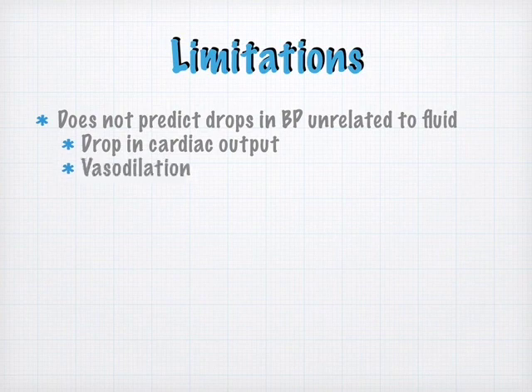output. Also with vasodilation, if you have a person who dilates out for anaphylaxis or sepsis or something like that, blood pressure drops. It's not because of fluid removal during dialysis that causes it. It's just that dilation makes your tank bigger. Your bigger tank means you have less resistance. And dilated out veins decrease your preload because they're dilated. So in that case, that person would probably need fluid. But if preload, afterload, and contractility are the three determinants of stroke volume, then preload is the one that we're watching with the continuous hematocrit monitoring, but blood pressure can drop because of contractility or resistance issues also.